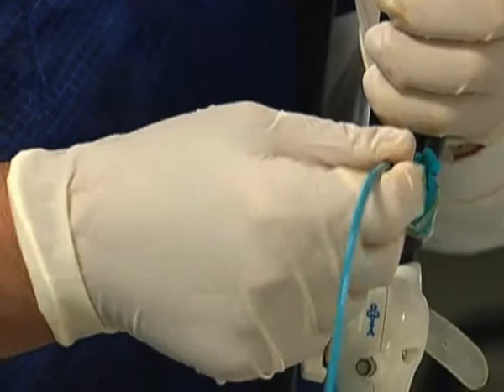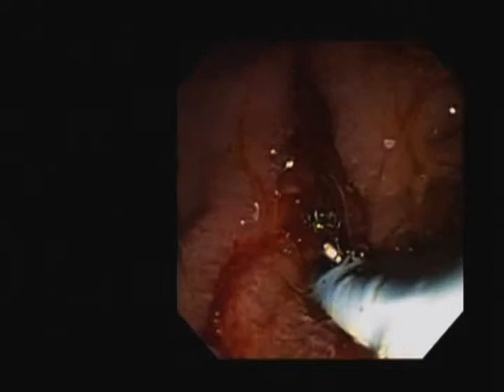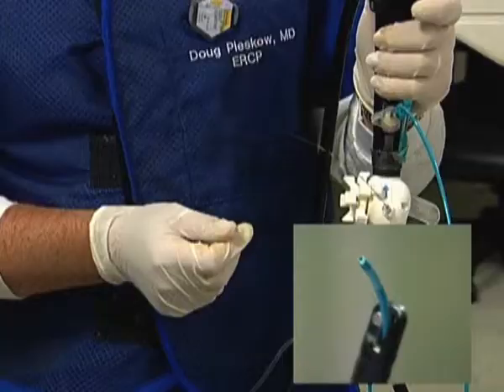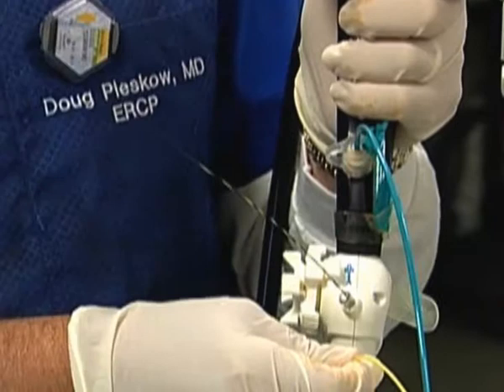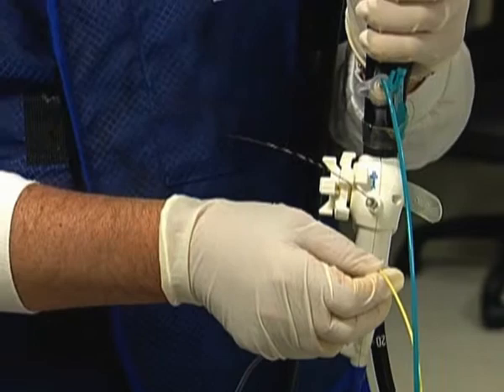I'm going to advance this into the bile duct, and we can do that under endoscopic vision. We can also use fluoroscopy to tell us where we are. We're well within the bile duct right now. Now I'd like to pull the guide wire out — when I pull the guide wire out, it gives me better ability to move the tip in four directions. Having the guide wire as a ramp will inhibit whether I can move this back and forth and up and down to its fullest extent, so that's why we like to pull it back into the spy scope.